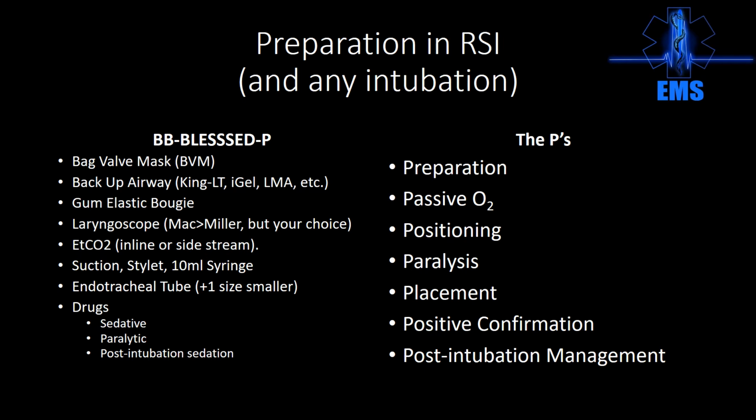The whole idea for this thing is to overcome airway resistance by collapsed airways at the top of the glottis, right? So this is most beneficial for patients who have a lot of subcutaneous fat, who have very proud tonsils, who have large adenoids. We're trying to literally blow air past that tissue, and in order to do that, you need pressure. The pressure comes from the volume. Crank the volume up.